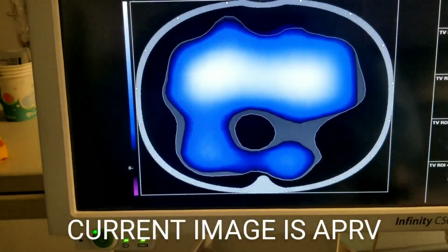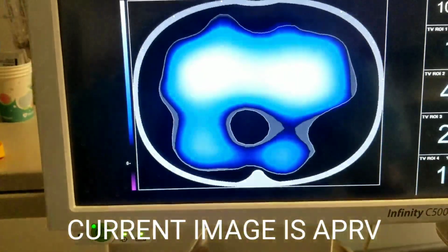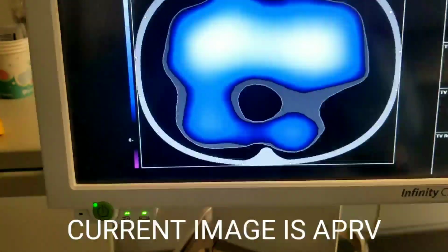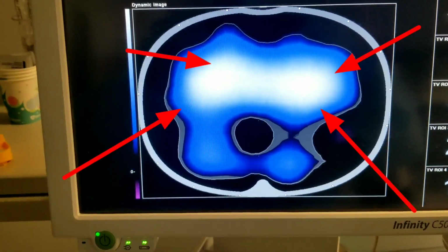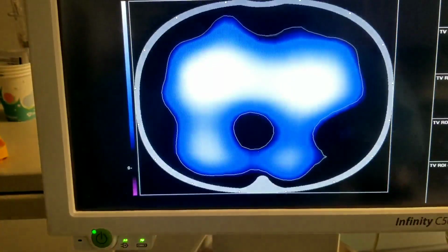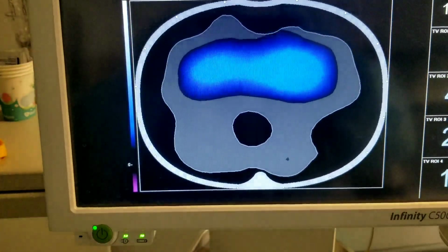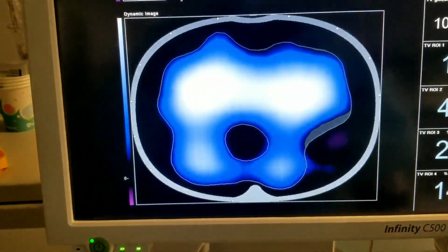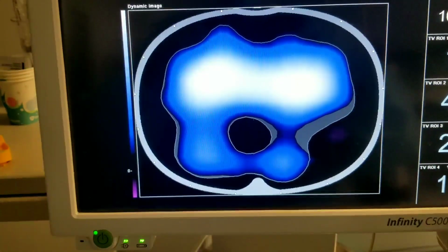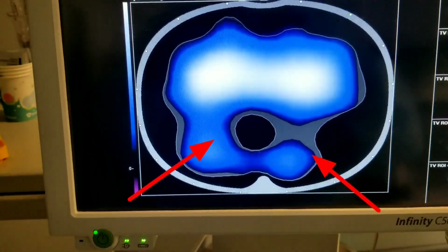in the PulmoVista, initially I don't have the initial images, but most of the ventilation was going to the ventral regions. We tried some recruitment maneuvers, and we could see that there was some potential to open up the dorsal regions, but it required high pressures. So during the recruitments, we were able to somewhat open up the dorsal regions, but then after it would close up.